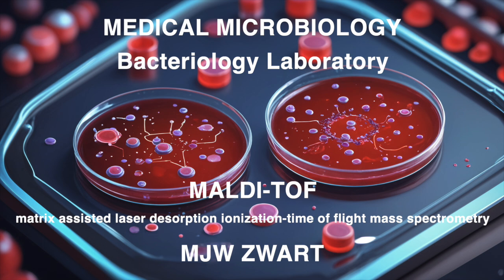Good news is it's pretty stable. The source says you can store it at room temperature for 2 weeks. That is handy. Okay, next reagent on the list, the Bacterial Test Standard, or BTS. Our old friend. Yeah. As we talked about, it plays a crucial role in validating the Microflex. What makes its preparation so, I guess, special?